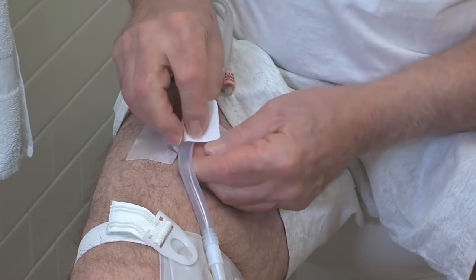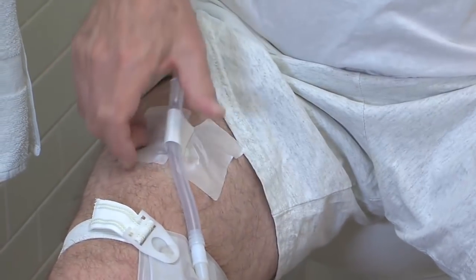Both catheter bags should be used with a securement device. A securement device is a device that is applied to your leg to reduce tension on the bladder and keep the catheter from being unnecessarily pulled on. It's important to ensure the securement device is in the proper location and allows the catheter to drain without obstruction. If a securement device is not available, you may use tape to secure the catheter properly to your leg.